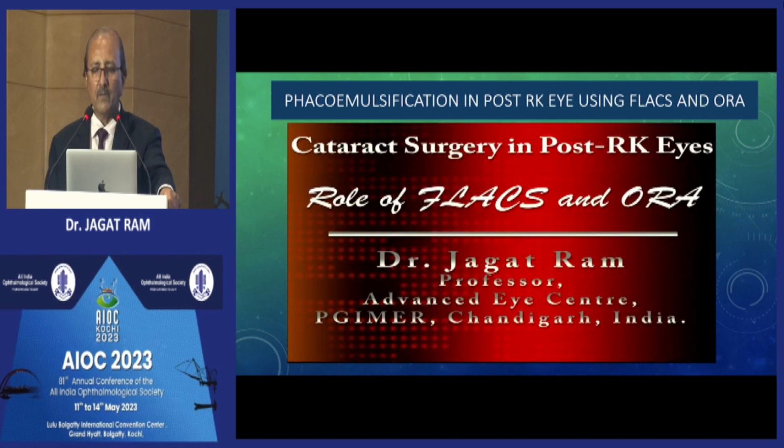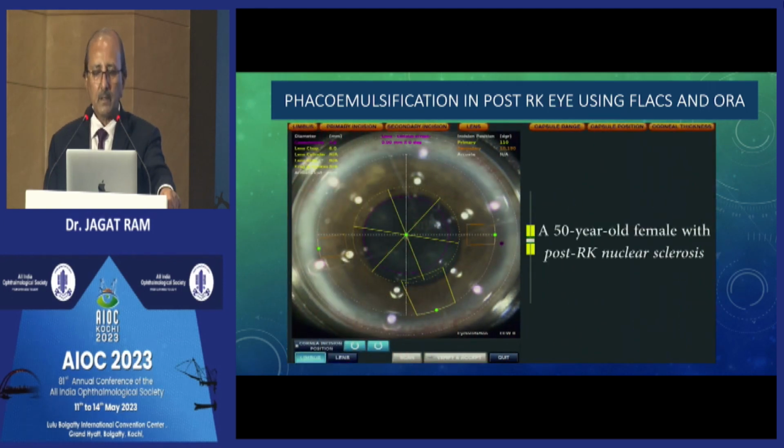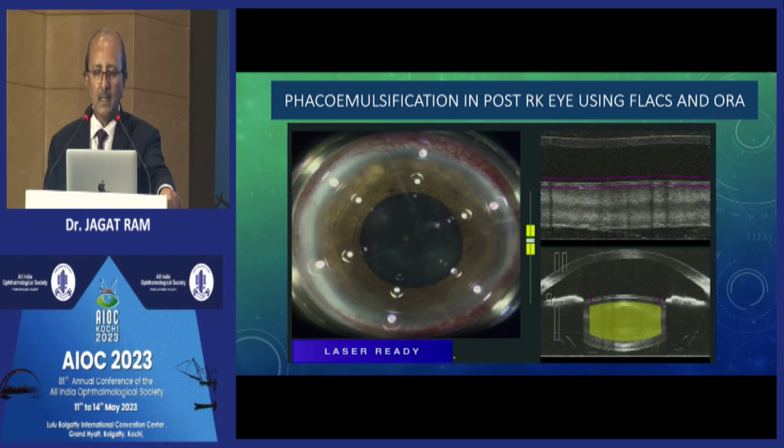And then comes some of the other conditions where there is a radial keratotomy. When we started doing it, it was a question of comparing it with the other modalities. Incisions are adjusted between the radial incisions.